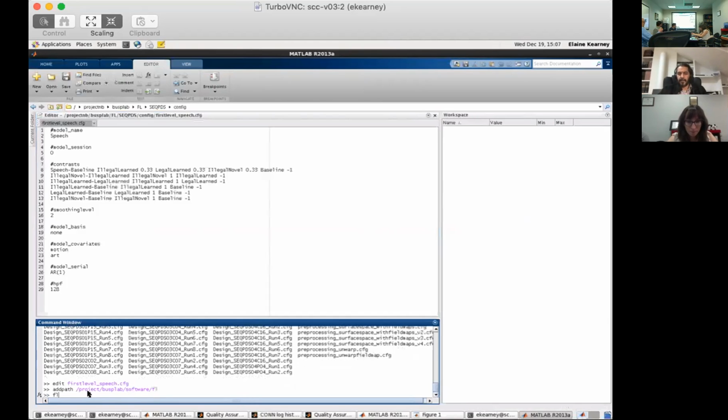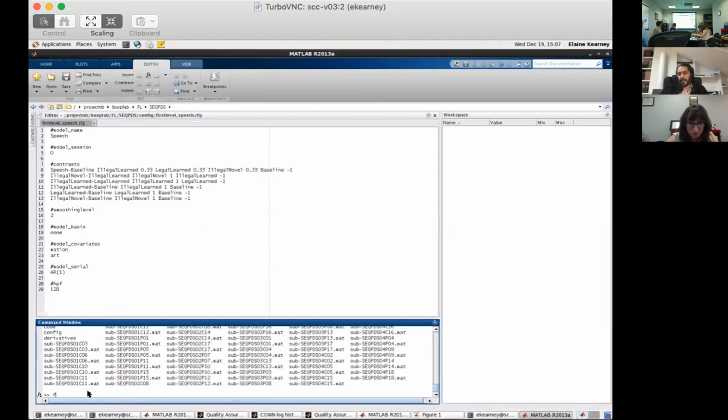Right, Alfonso, those violin plots report the subjects that had higher max motion, but trials are removed where that motion occurred, right? Right, exactly. If you use ART with the default settings, anything above, I think, 0.9 millimeters scan to scan, so one acquisition to the next, gets removed automatically, or basically gets labeled as an outlier. As long as you enter the ART file, as in this case, in the model covariates field, it is going to be entered as additional regressors into your SPM, so they're going to be effective.